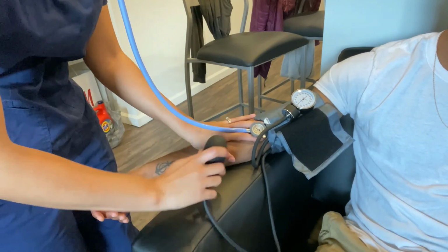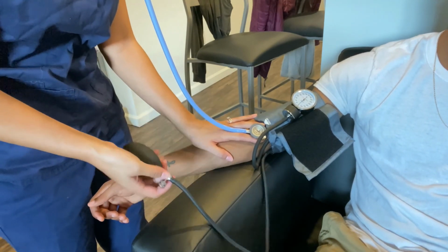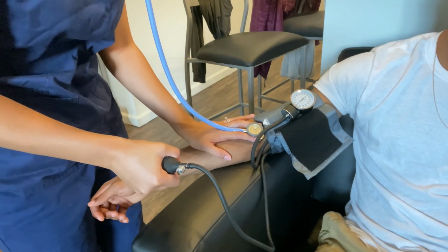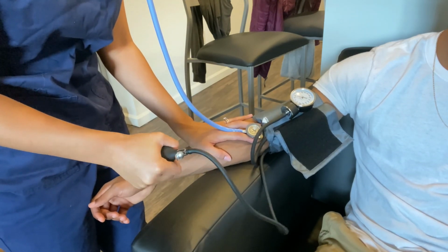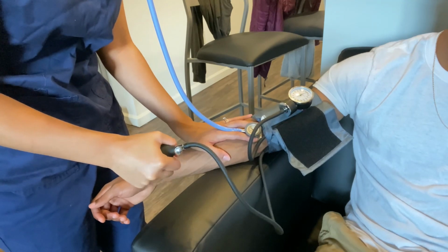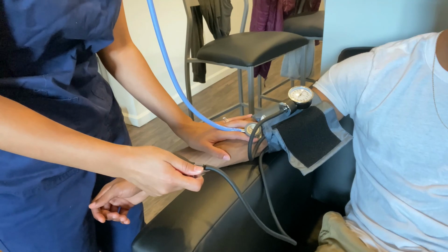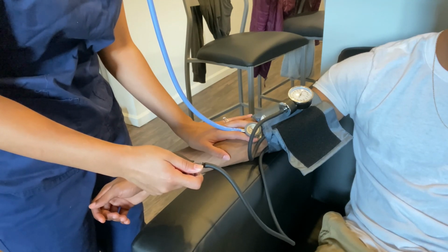And then I'm going to grab the pump. Make sure that the valve is closed right here. Now I'm going to pump to about 160. And very slowly, I'm going to deflate the pump and open that valve.